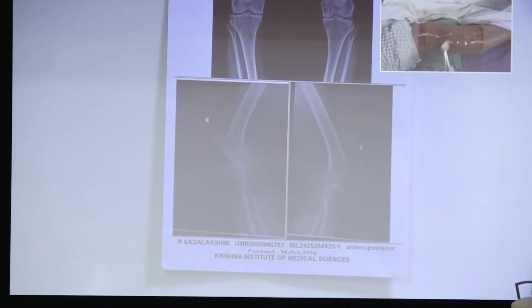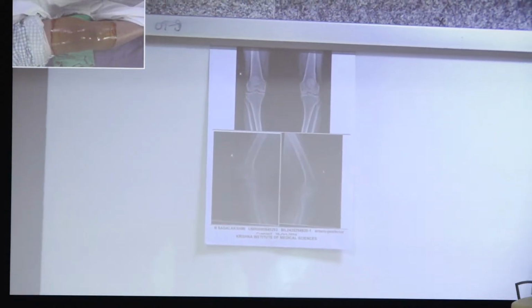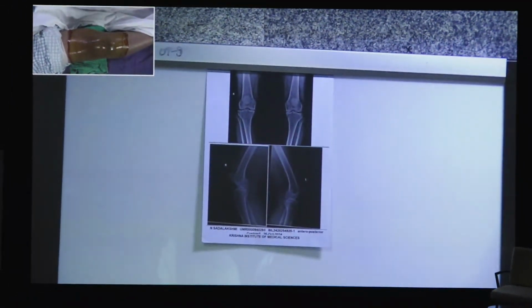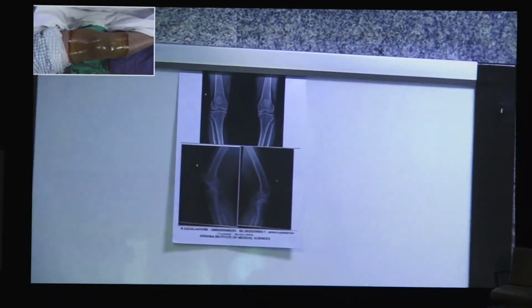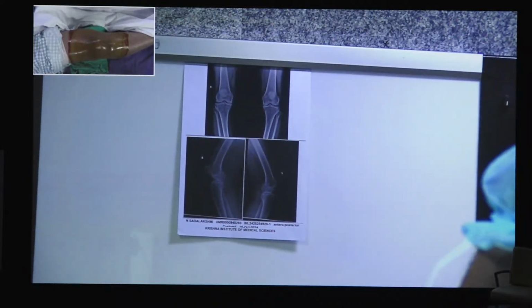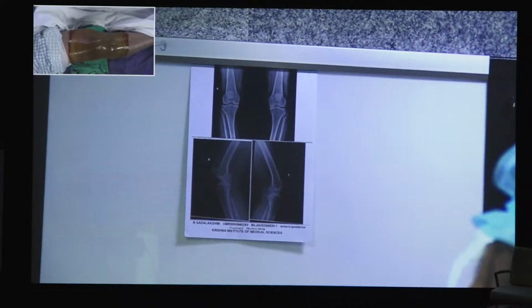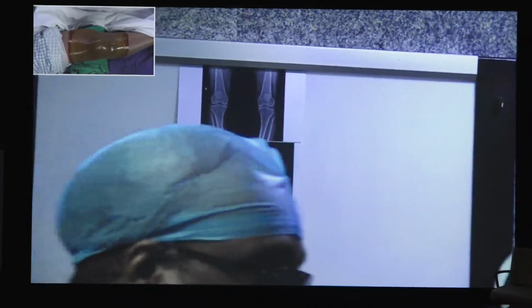Yeah. So we are demonstrating a genicular RF for this patient. She doesn't have lateral side pain. So we'll be demonstrating superomedial and inferomedial. Yeah, Dr. Tushar would be... superomedial, inferomedial, and the medial branch to the vastus intermedius. Okay. So these three we will target.